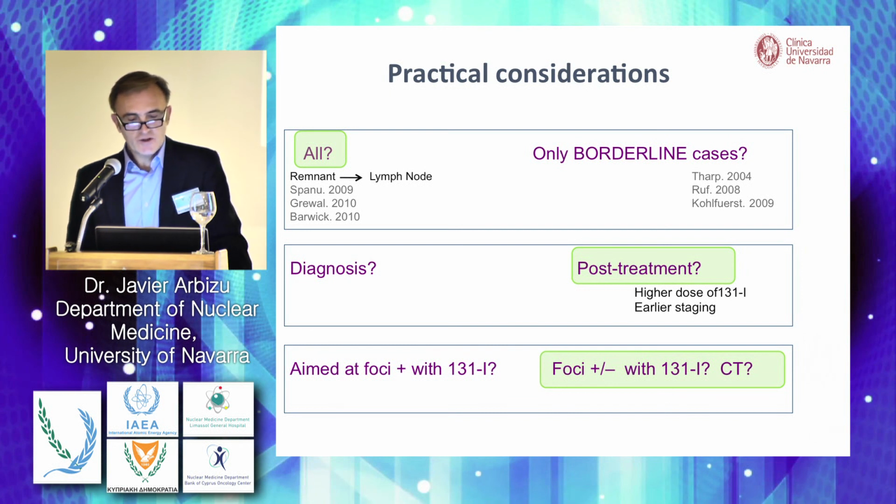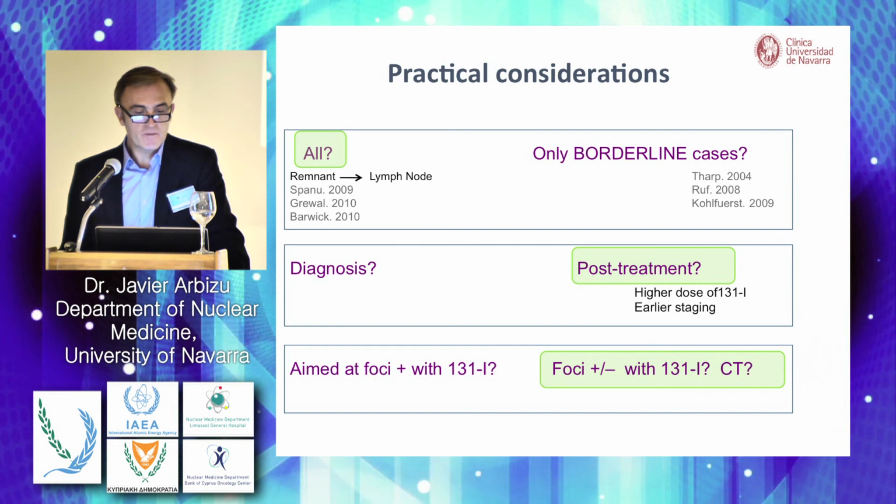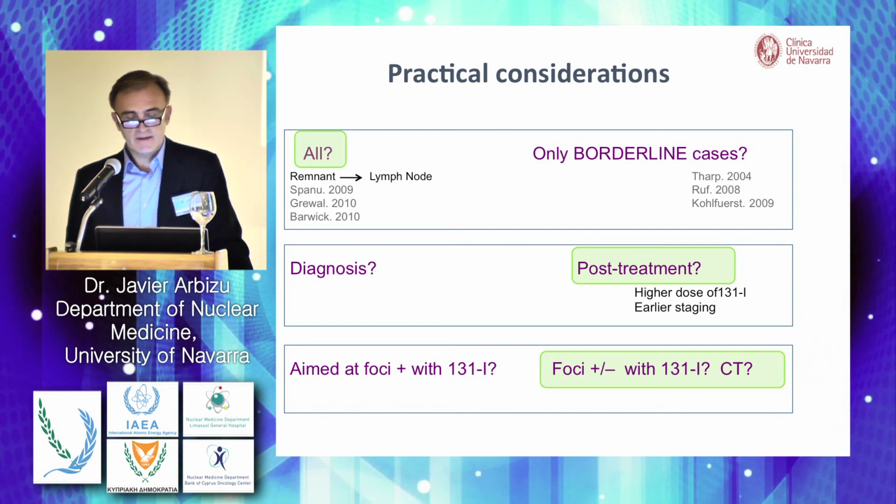What about the diagnosis before and post-treatment? Post-treatment, of course, because we are not performing, in general, a diagnostic scan after the surgery as a rule. And what about aiming at a focus that is positive or equivocal?